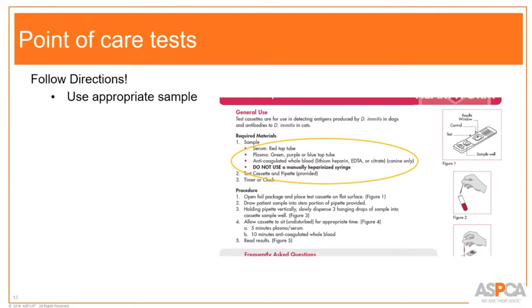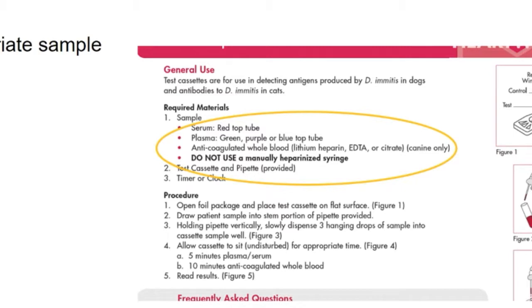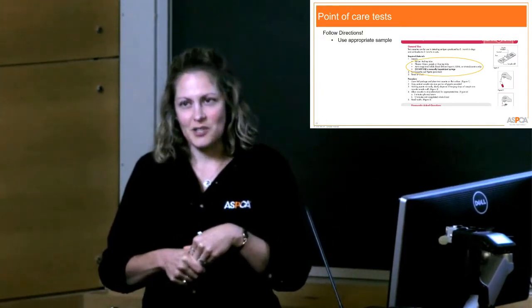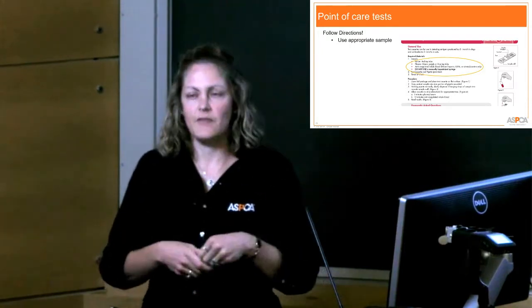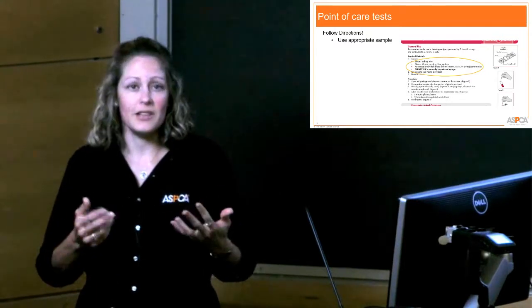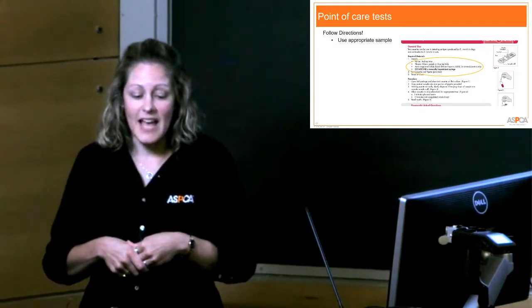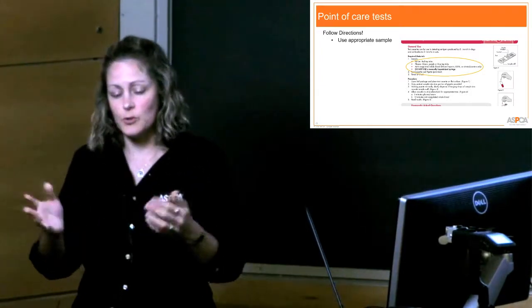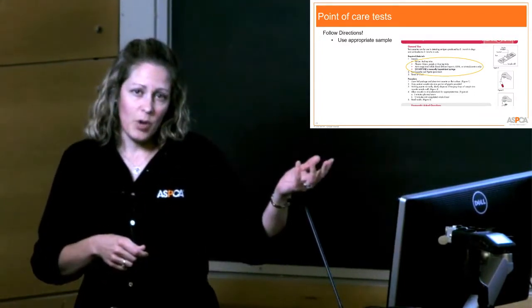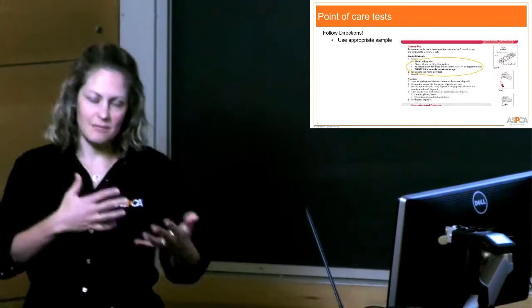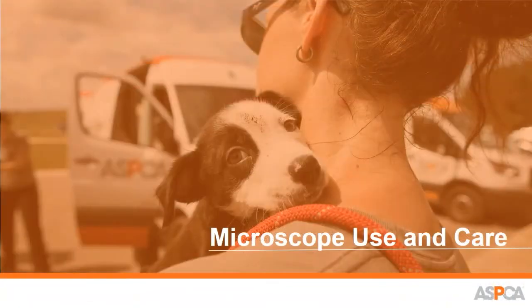Make sure you're using the appropriate sample. One test specifically says you can use serum, plasma, or anticoagulated whole blood, but do not use a manually heparinized syringe — yet many shelters do exactly that. Instead, draw your blood sample and put it in a purple top tube. That also gives you a backup sample if a test fails or doesn't run correctly, so you don't have to redraw blood.